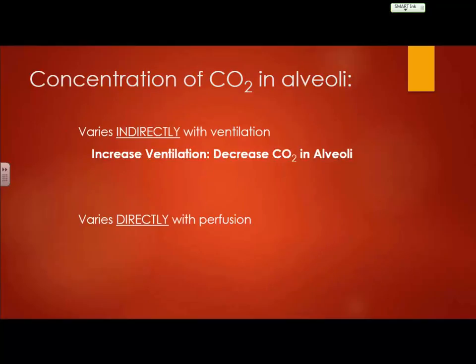How does the concentration of CO2 in the alveoli indirectly vary with ventilation? If you have an increase in ventilation, you may have a decrease in CO2 in the alveoli. All right. Not giving you a chance to switch. Right, right. So think hyperventilation, right?